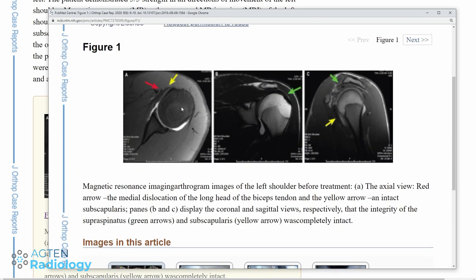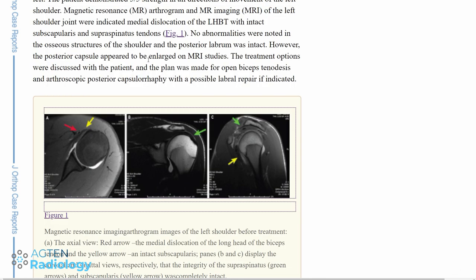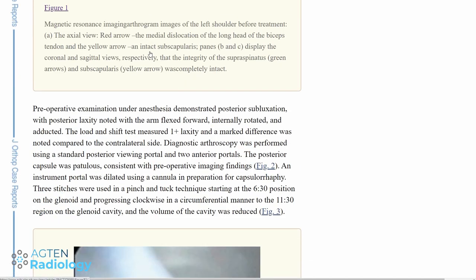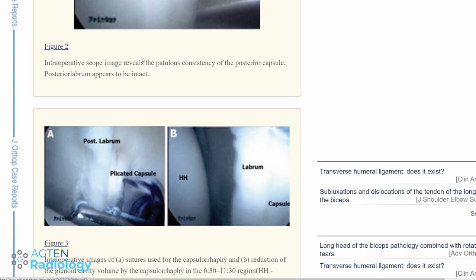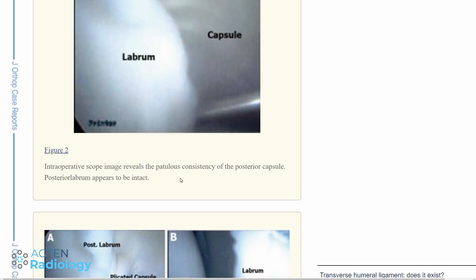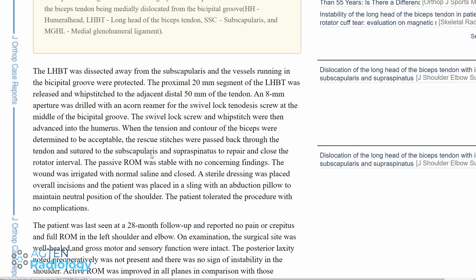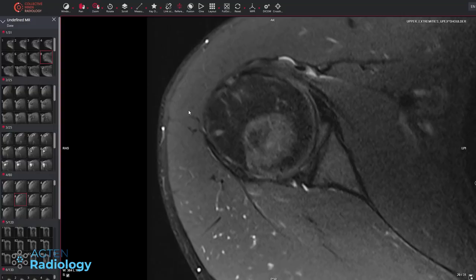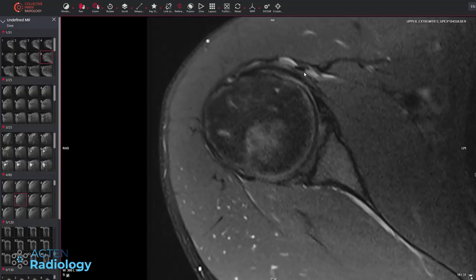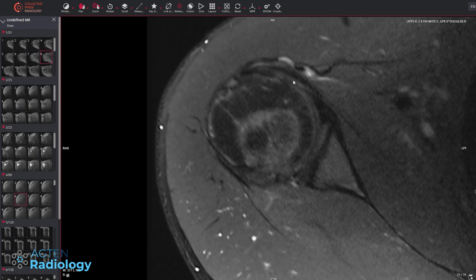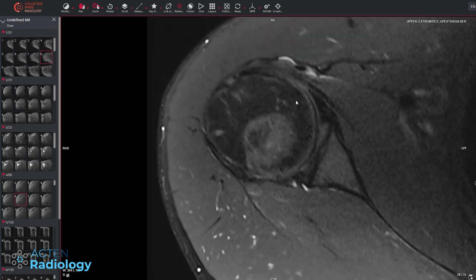I don't think it's a variant — I think we would see it more often if it were. If you know of such a variant, please send me the article and I'm happy to make a video about it. Going back to the case: long head of the biceps tendon with edema around it, medially dislocated outside the joint, with intact subscapularis tendon. Then we move to the joint.